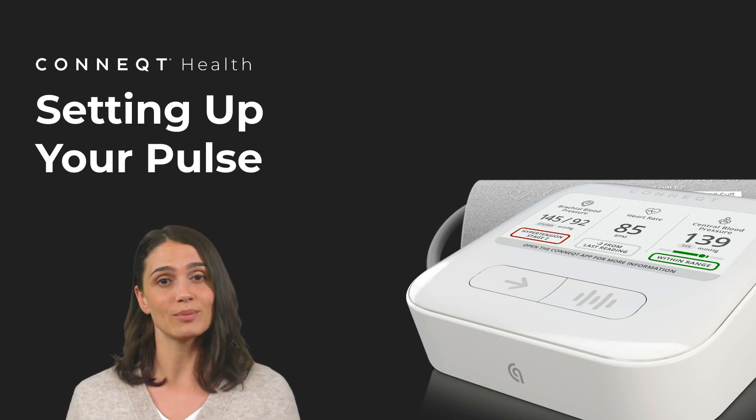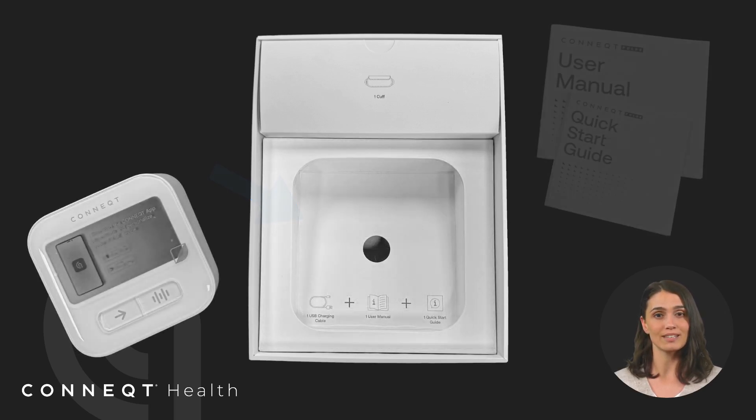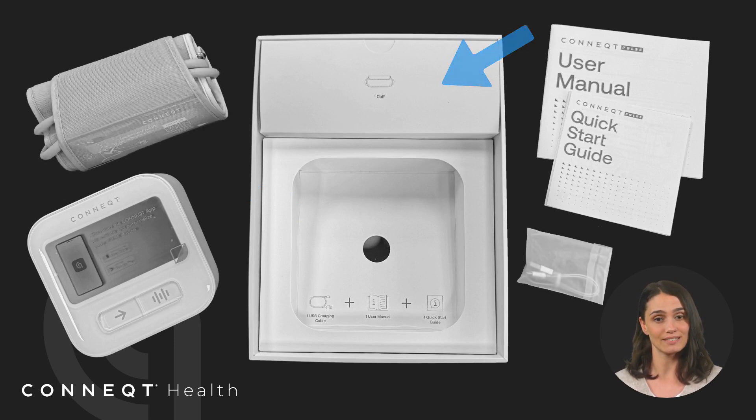Let's begin setting up your Connect Pulse. Inside the box you'll find the Pulse device on top. Lift that out, and underneath you'll find the Quick Start Guide, User Manual, and Charger. The cuff is stored in a separate compartment above the Pulse.